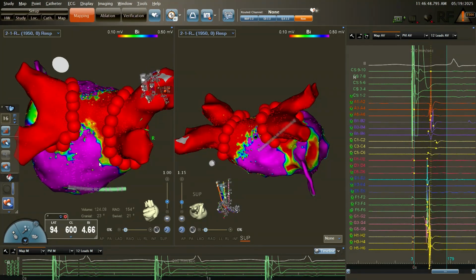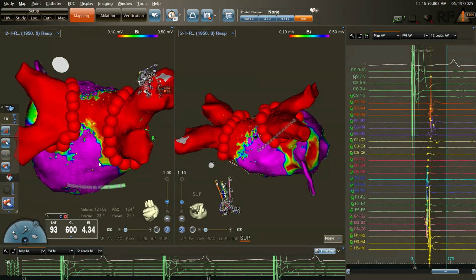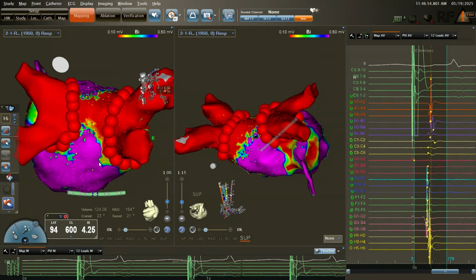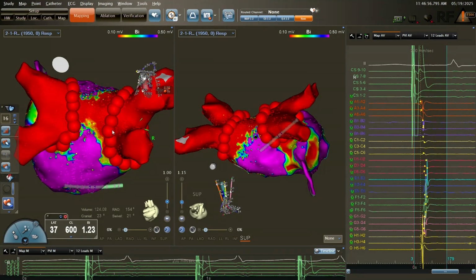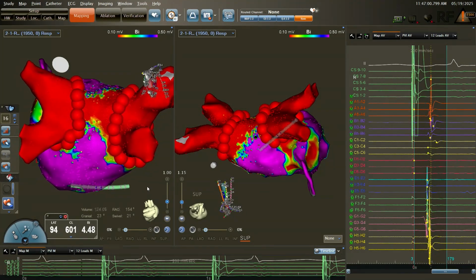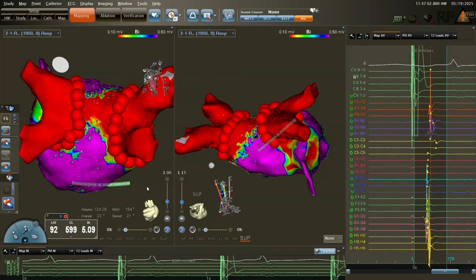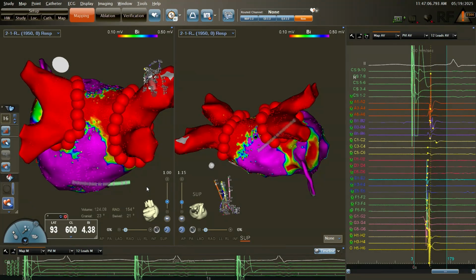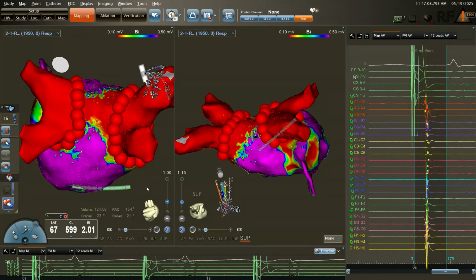It may be that with monopolar, there's a bigger spread of the lesion, and it's an actual lesion. It may be that there's significant stunning that doesn't reverse during the procedure. So this is information we're going to understand better when we finish the remaps. Anyway, those are the possibilities.